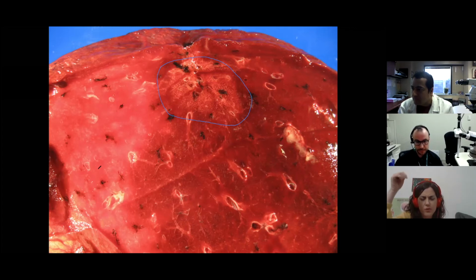They don't use these harpoons or needles; they put something that helps them to see it, and they sent me one like that, and I was so proud because I found it just by slicing, but then it turned out to be papillary. It looked just like that, but it was fully papillary, and I think papillary can look ground glass also.